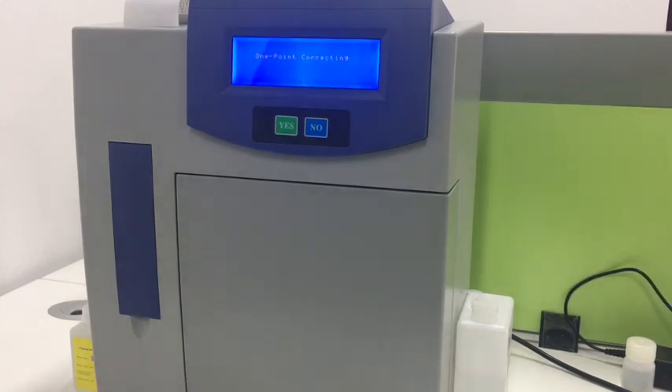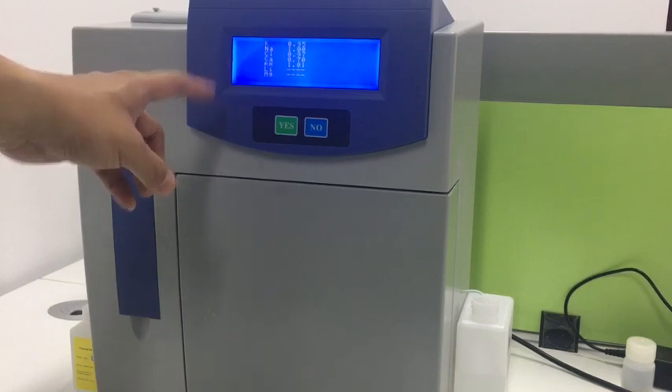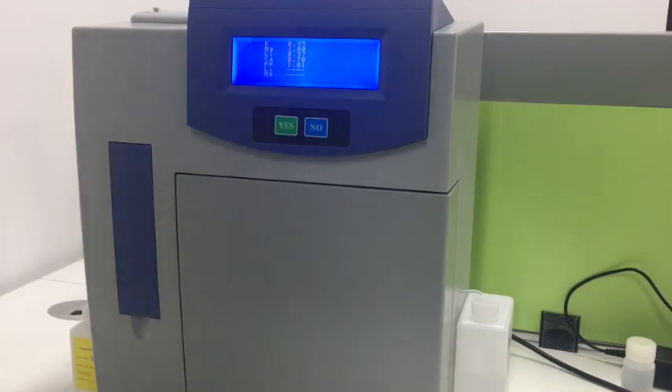We still need to wait for a while. Later, it will show the cluster. This is the correction factor for each parameter. After that, it will show the main menu.